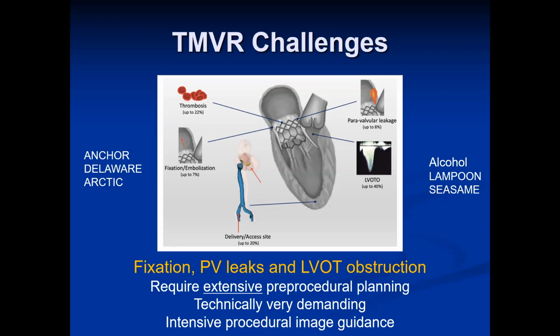Does the duration that the clip is in place affect the repairability of surgery? In other words, you wait. Yes, the answer is yes, because there's more and more scarring. That thing looks like an alligator clip. And the more scarring there is, the more unlikely you are to repair it.